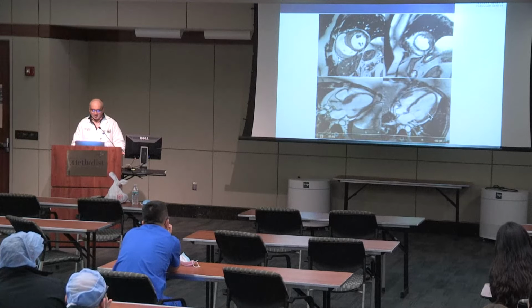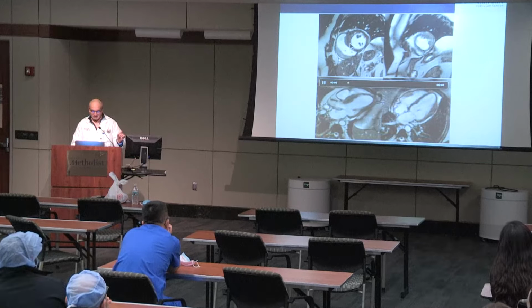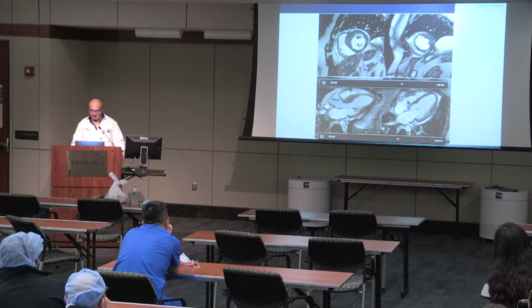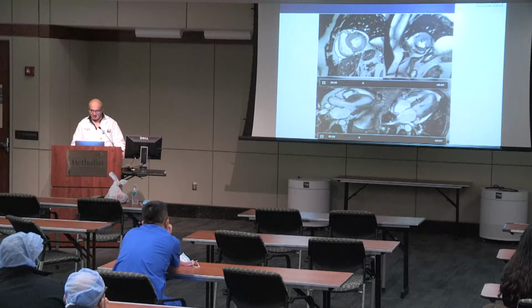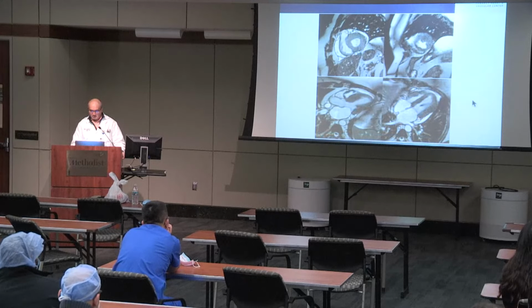Okay, so a couple of things I'll point out. One is, yes, the basal septum looks like there's increased thickness. Overall LV function looks preserved, right? What do you think about the RV? It looks to be pretty normal cardiac function.